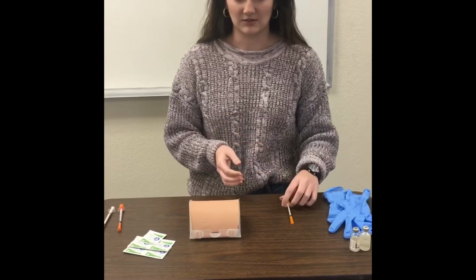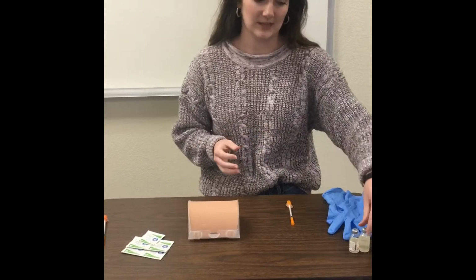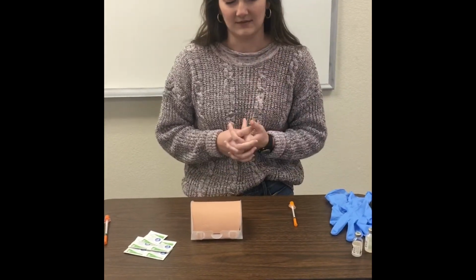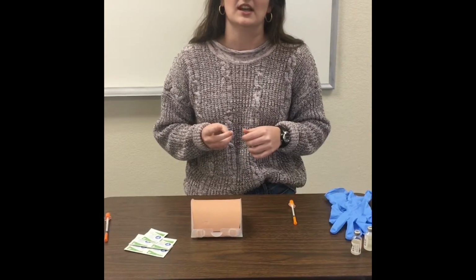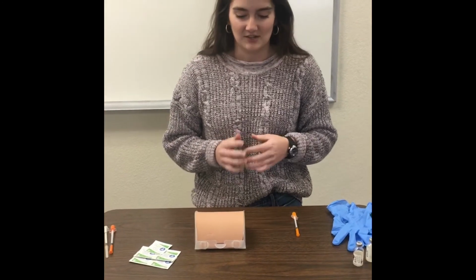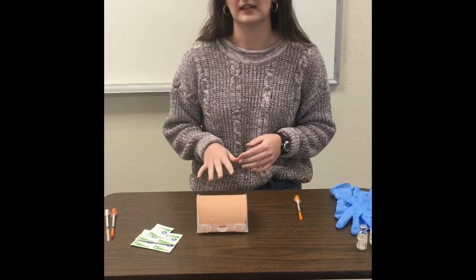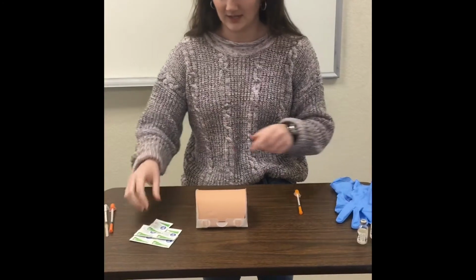I'm going to check my doctor's orders, and it says 5 units, so that's how much I will be getting of the cloudy NPH and the clear regular. After that, I will identify the 6 patient rights: right dosage, right documentation, right drug, right patient, right route, and right time. After I do that, I'm going to check any allergies of the patient and bring an antidote, glucagon, if their blood sugar is really low. Then I'm going to wash my hands and begin getting the supplies.